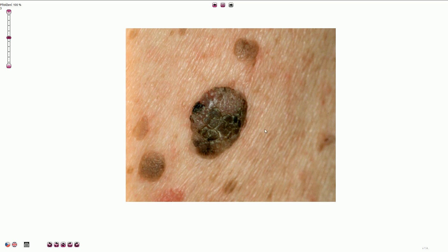Here we have the macroscopic picture of seborrheic keratosis, which is very common among elderly people. It is usually multiple, as we can see here, and it looks like hyperkeratotic papules measuring from several millimeters to one to two centimeters. It has usually a brown color because of melanin pigment content, a papillomatous surface with greasy friable scales, and it has a classical stuck-on appearance.